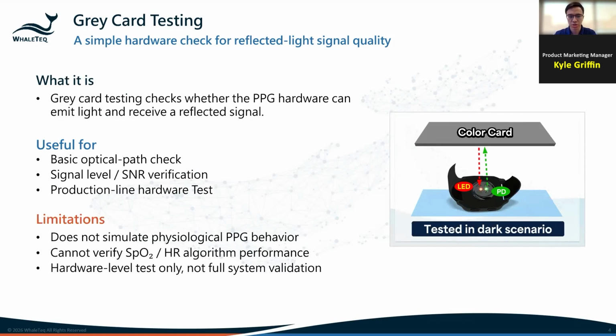The limitations are, it does not simulate physiological PPG behavior. It cannot verify SpO₂ or HR algorithm performance. And it's a hardware level test only. It's not a full system validation.